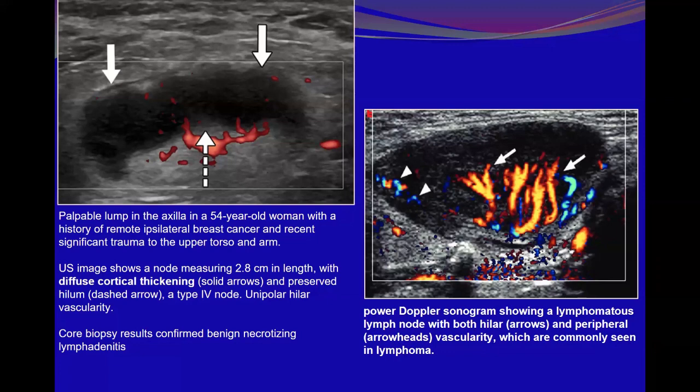This is actually strange. But from what I see, sometimes I can see the power Doppler in orange. All the image, all the colors are in orange, unicolor, or in blue as here. But here both colors are present. Yes, but I don't know. Maybe it is not a power Doppler. Maybe other modes. I don't know. Okay, we can search about that to know what is the cause for this.